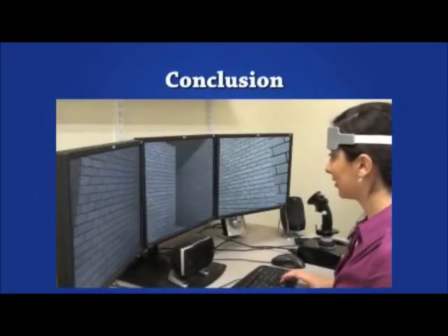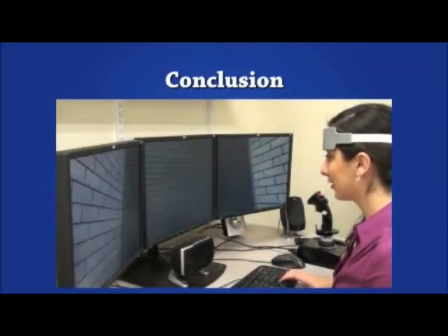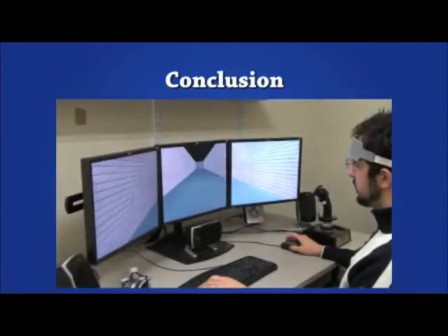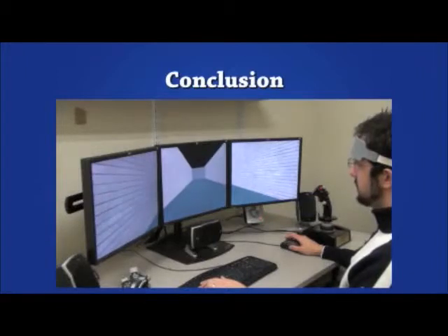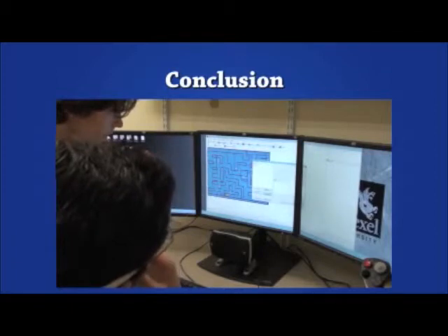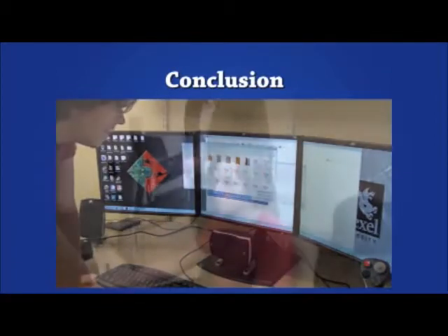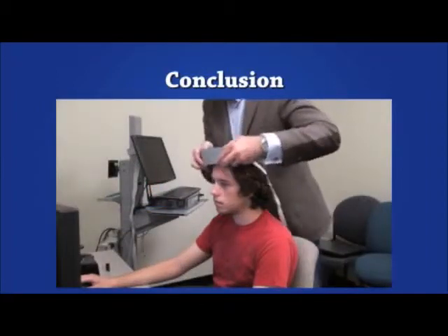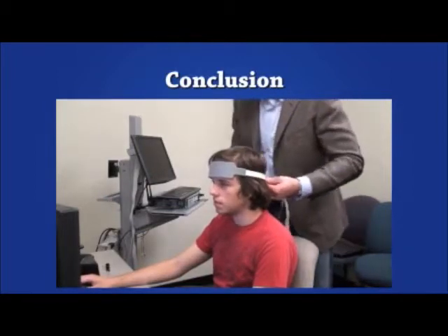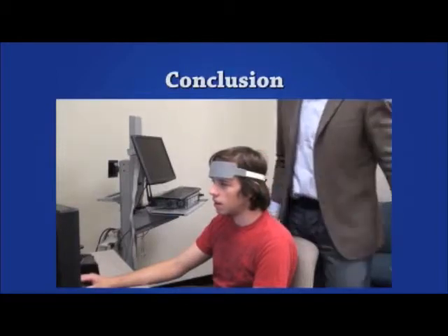In conclusion, this exploratory study demonstrated the use of Maze Suite and FNIR to study neurobehavioral aspects of learning in spatial navigation. Maze Suite enables the design and application of simple 3D environments with a user-friendly graphical interface, and it automatically records behavioral measures for within subject or across subject comparisons. FNIR is a portable, safe, and non-invasive brain monitoring tool that has been used in clinical, laboratory, and natural settings to study brain activation. We hope this presentation was helpful in explaining these tools.